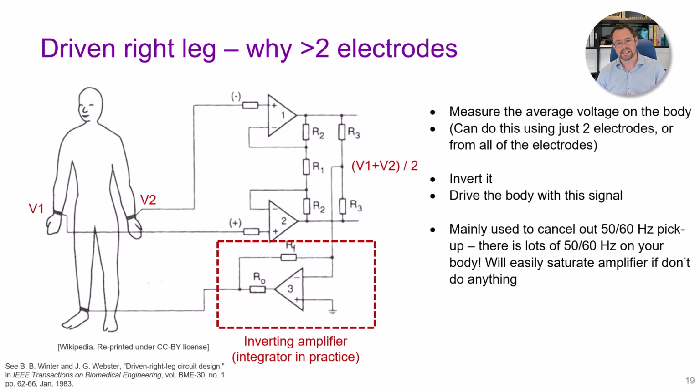There's a screen, there's a computer, there's the lighting, there's the power wires for the plugs, all of that sort of stuff. So we've got some wire in the room. Let's draw it like that. And in the UK, it's got a sinusoidal signal which is at 50 Hertz. In the States, that's typically at 60 Hertz.